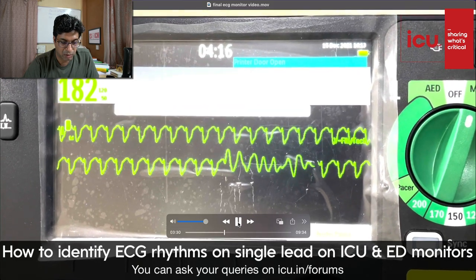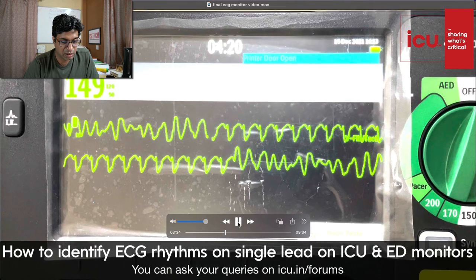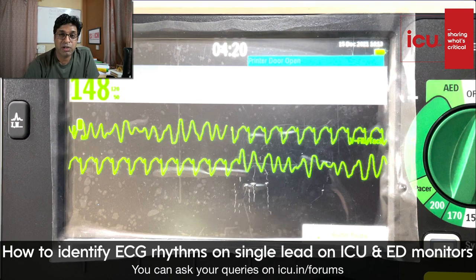Okay, now this has changed. The rhythm has changed. You see, the complexes are not of equal sizes, they are a little bit small and of different morphologies. So this is VF. Now VT has converted into ventricular fibrillation.